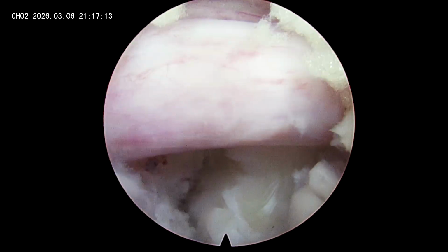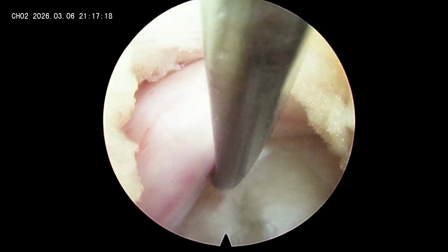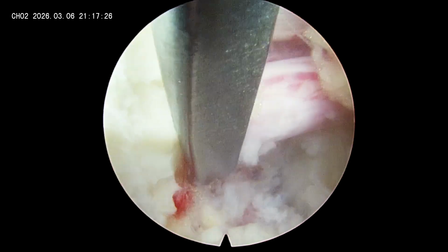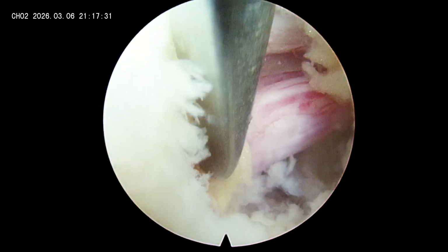So we are done here. You can see the traversing nerve root is completely decompressed. I can retract the traversing nerve root very easily here. The underlying hardened annulus has been removed. So there doesn't look like any free fragment here.